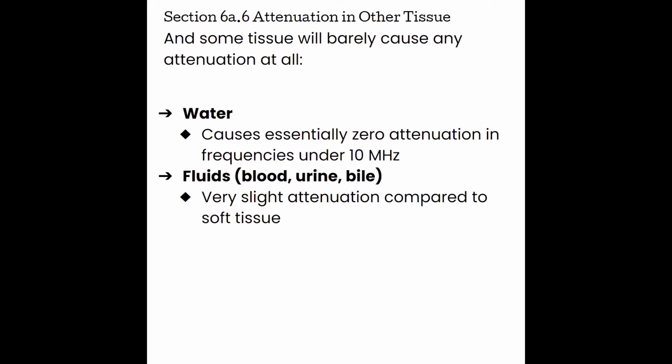As a sonographer, it's very important that we remember fluid-filled structures do not attenuate sound. It can actually help us in making a diagnosis of cystic structures that we see around the body. In the setting of gynecological ultrasound, we have our patients fill their urinary bladder, so when we go to look at their uterus, it acts as a window to the uterus. We use that very little attenuation through the urine to get a very nice look at the uterine muscle. So fluids around the body cause very little attenuation and can be very helpful for not only diagnosing, but serving as windows to other structures in the body.